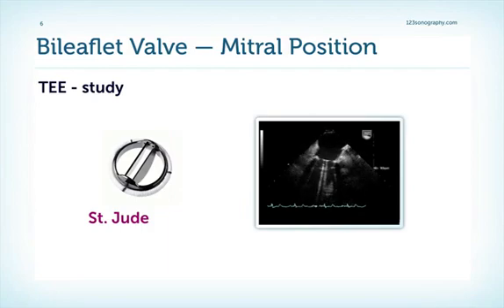Here's an example of a TE study where we can nicely see again the opening and closure of a bileaflet valve. The best way, however, to really visualize the valve is, of course, fluoroscopy. But we'll talk about the value of fluoroscopy a bit later.